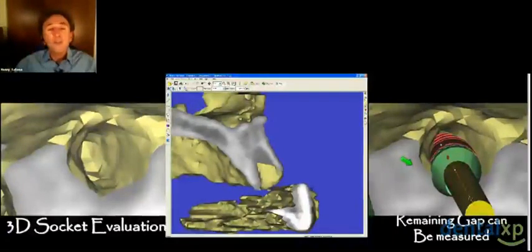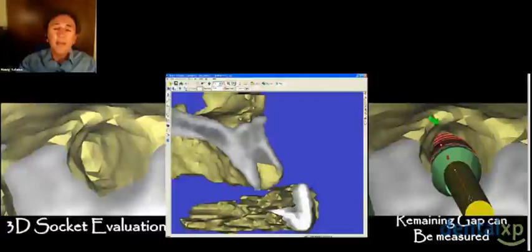That's where the macro geometry of the implant design comes in. We look for an implant that has a good thread design that can give us primary stability well into the range of 60 to 70 newtons of resistance. We also want a diameter that allows us to maintain a gap between the labial plate and the implant of between 1 to 1.5, at the maximum 2 millimeters.